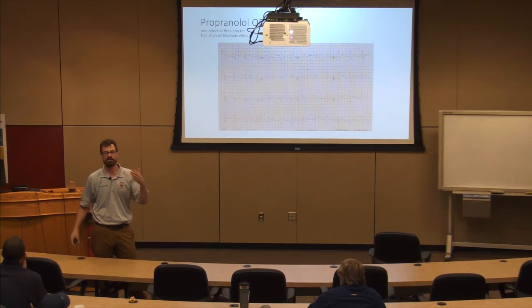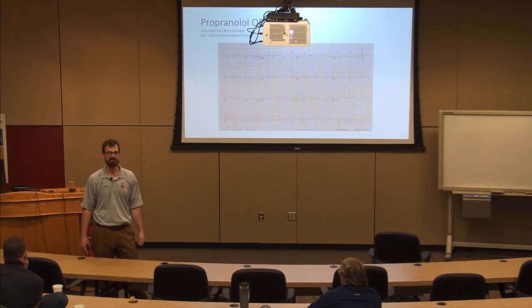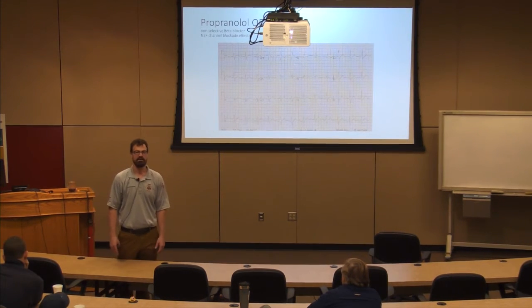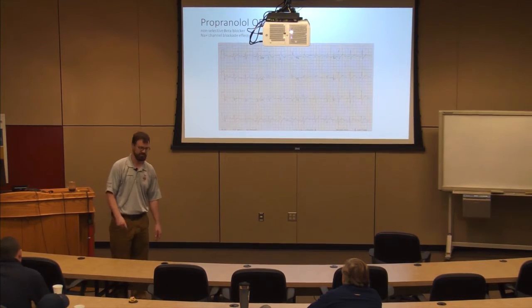But if you get somebody on Flexeril who's overdosed and you see a wide QRS and you show up and they're sick as a dog and now they're in VTAC and seizing, and I say, why didn't you give sodium bicarb? And you say, because it wasn't a tricyclic, I'm not mad at you, I'm just disappointed. It'd be one of those things, right? I'm not mad, I'm just disappointed.